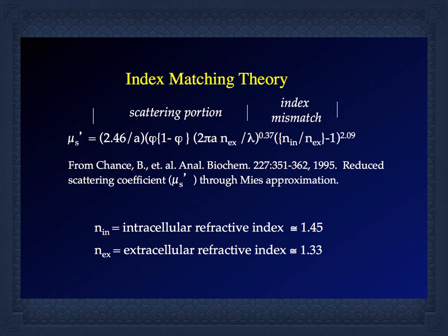But this paper is by a prominent optics pioneer, Britton Chance, from the University of Pennsylvania. It shows a Mie scattering or Mie approximation. The symbol on the left of the equal sign, we're just going to take to mean the total scattering here. And the exactness of the equation doesn't really matter. What matters is the factors that are in the equation.